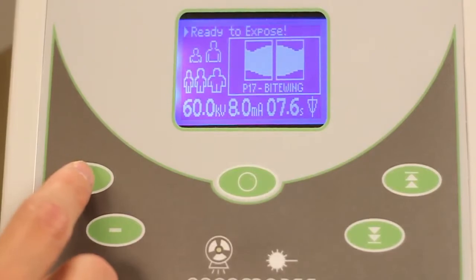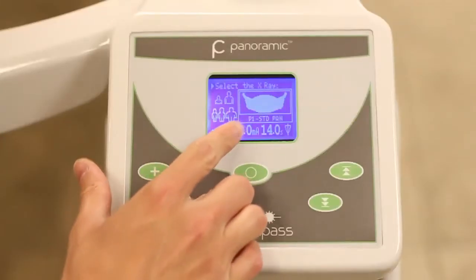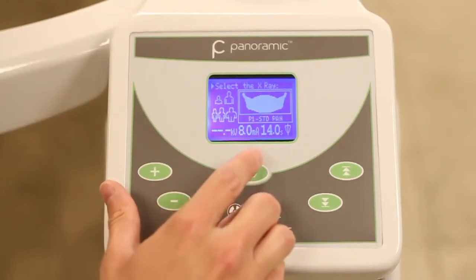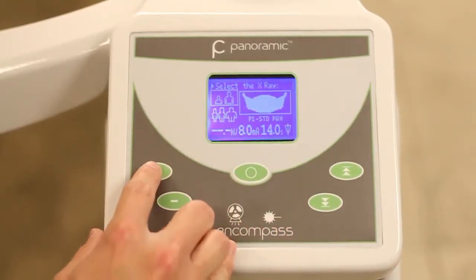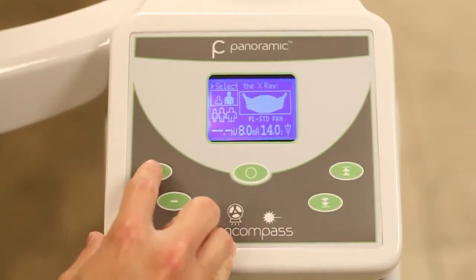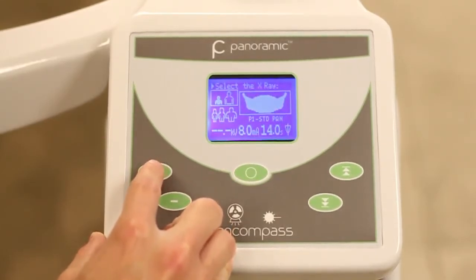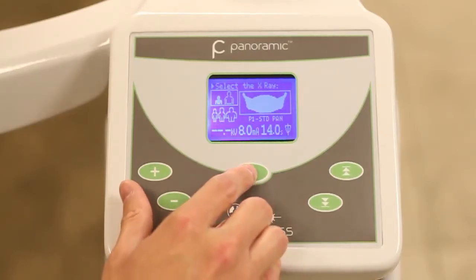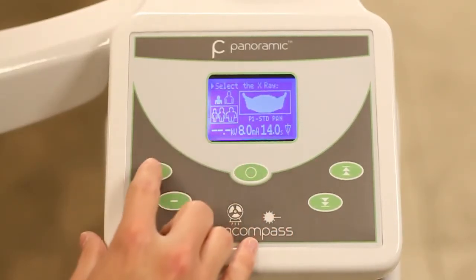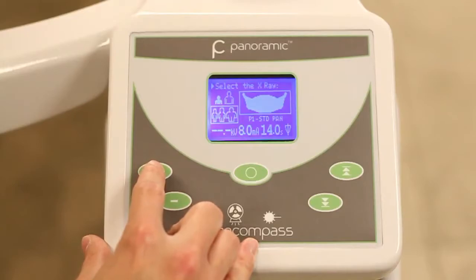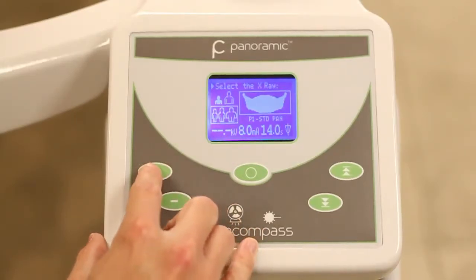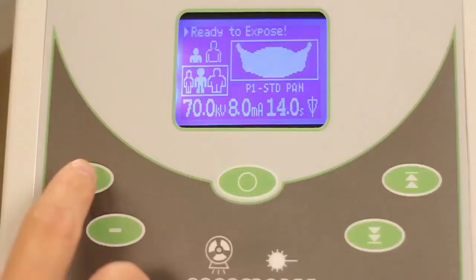Once the profile is chosen, press the select button to advance to the patient options: child or adult. Press the plus or minus button to highlight child or adult, then press the select button so the size of the patient can be determined. The highlighted box will now move to select the size of patient — small, medium, or large.